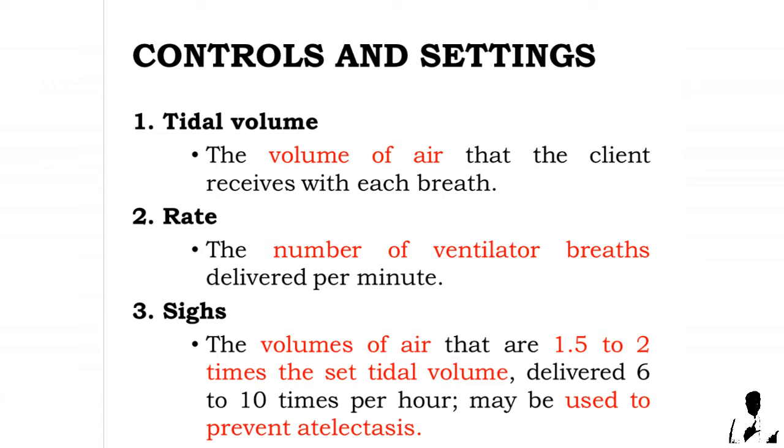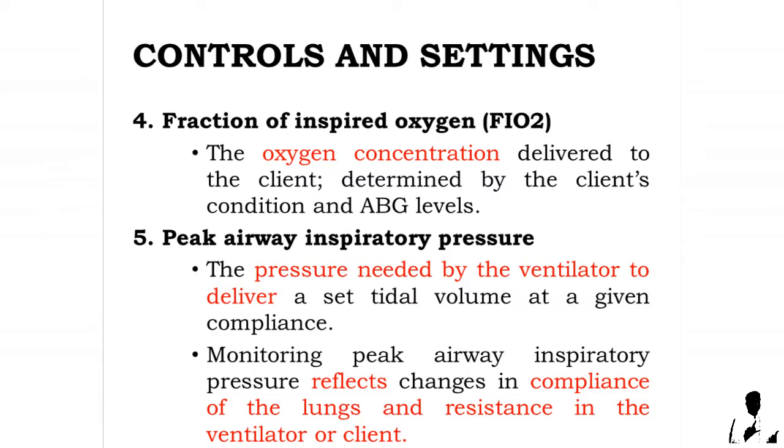3. Sigh, the volumes of air that are 1.5 to 2 times the set tidal volume, delivered 6 to 10 times per hour, may be used to prevent atelectasis. 4. Fraction of inspired oxygen, FiO2, the oxygen concentration delivered to the client, determined by the client's condition and arterial blood gas levels.